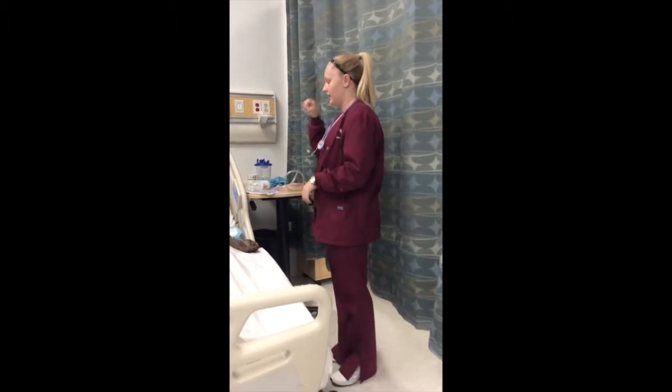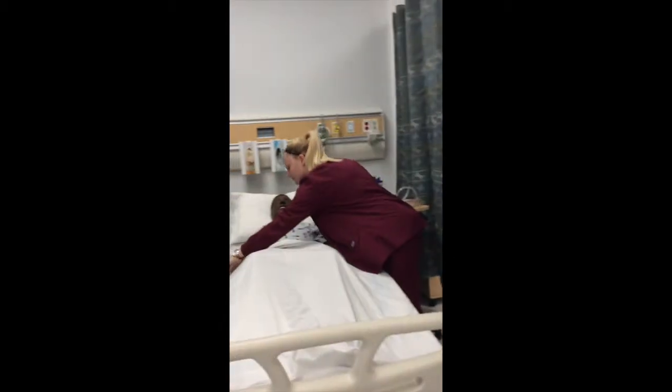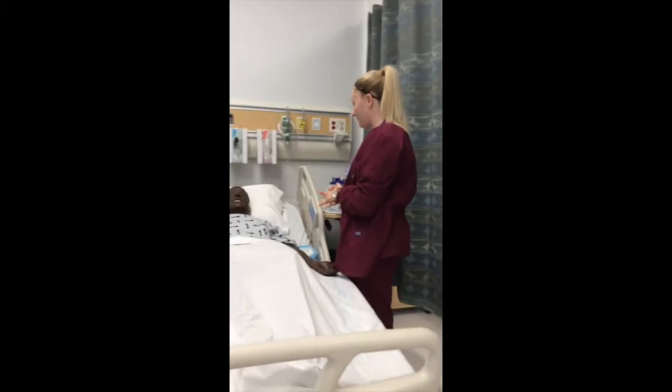So here we go. Knock, knock, knock. Hi, my name's Dusty. I'm going to be your student nurse today. Can I get your name and date of birth? Thank you. Do you have any allergies that I need to be aware of? Okay, and are you in any pain right now?